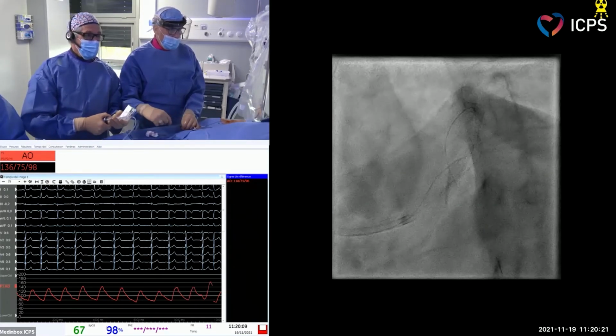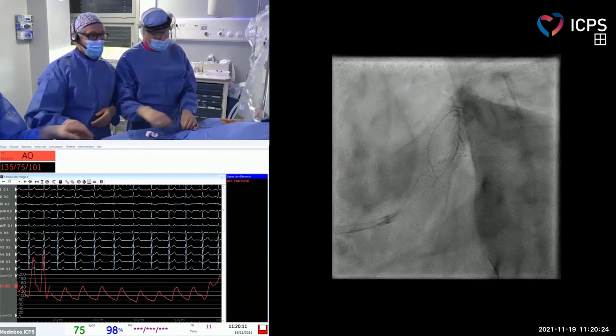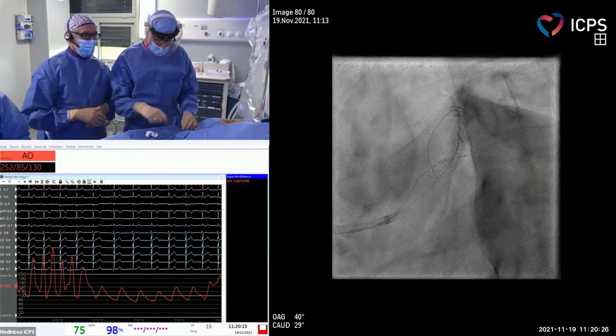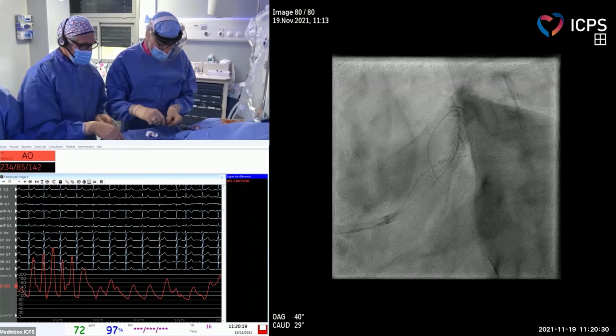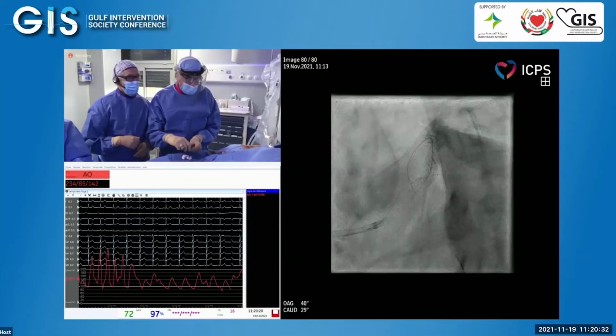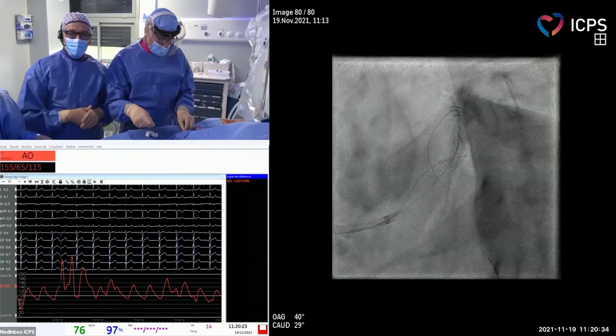So again, Thomas, take care of not doing a longitudinal compression of the stent. Yes. And now we'll use... Can we see the last stent boost? Yeah, on peut montrer le stent boost, s'il vous plaît, en régie.